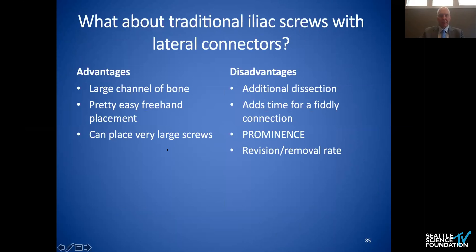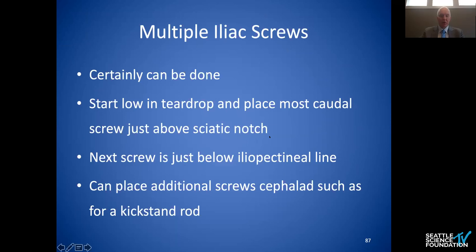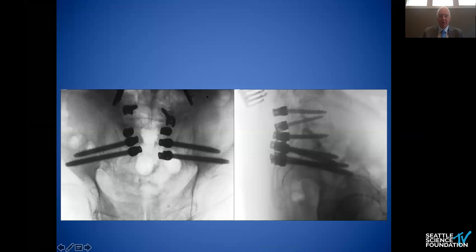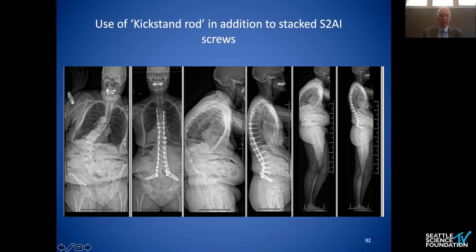For traditional offset connectors: you can get a large channel of bone for a conventional iliac screw, it's relatively easy to do freehand, and you can place large screws. The disadvantage is the dissection, connectors are always fiddly, and they tend to be prominent. Strategies to minimize prominence include recessing the screw into the ilium or placing it underneath the iliac crest. Multiple iliac screws can be done — start low in the teardrop and place the most caudal screw just above the sciatic notch, with the next one just below the iliopectineal line. On the navigation screen, I'm really trying to stay just above the sciatic notch, which gives more room for the second screw. If you're fluoro-based, this is what your fluoro shots should look like. You can also use a kickstand rod in addition to stacked S2AI screws.